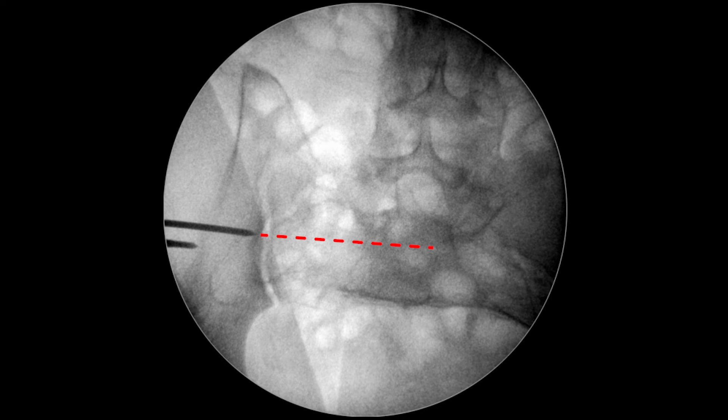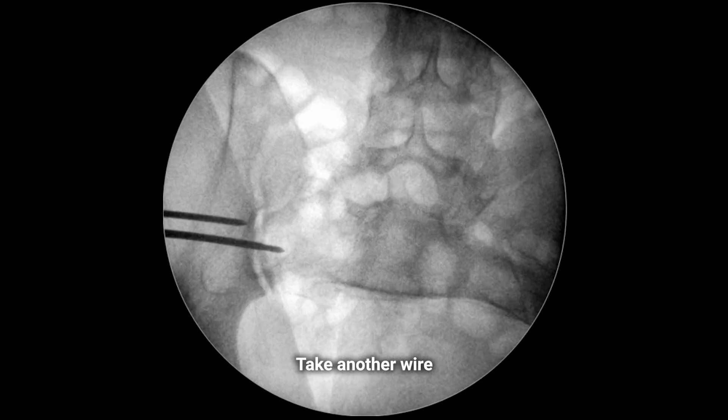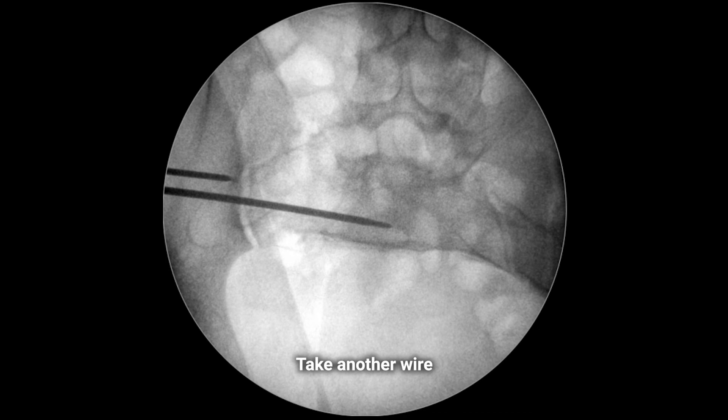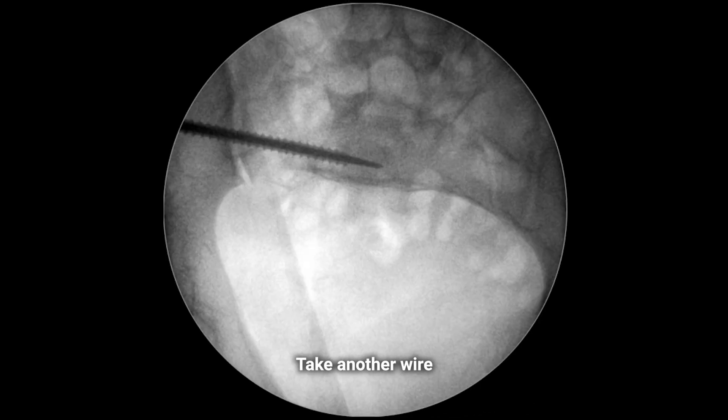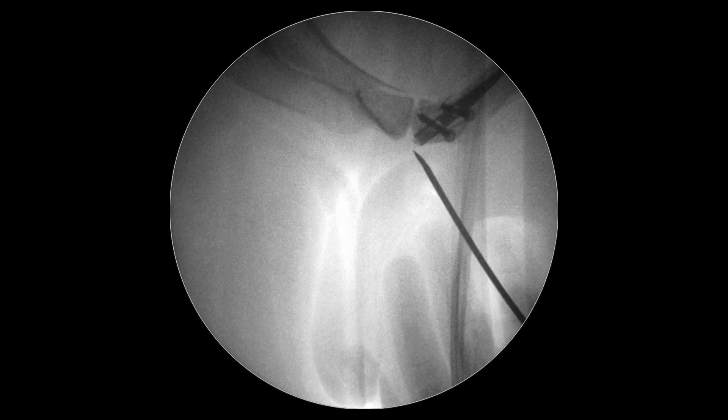It can be seen that the wire goes too far backward; the other view shows its normal position. We take a second wire and introduce it anteriorly to the first one, which serves now as a guide.